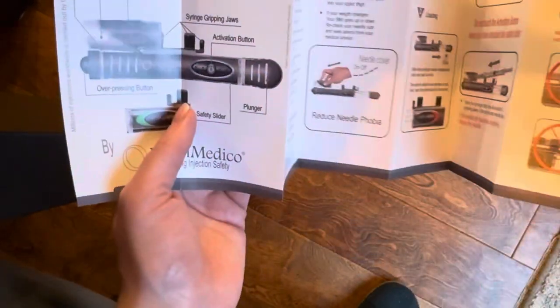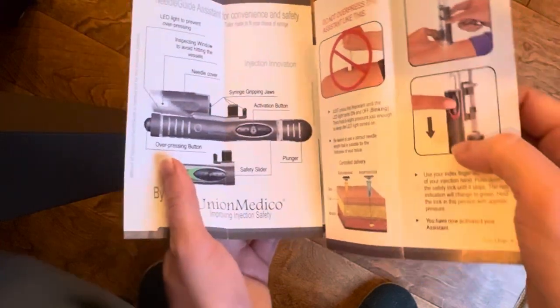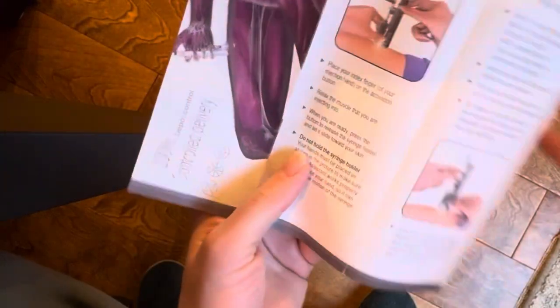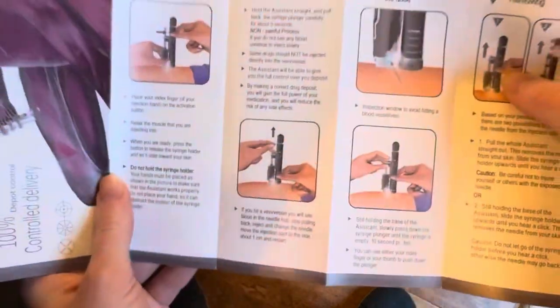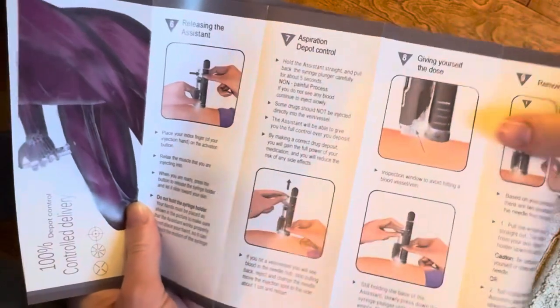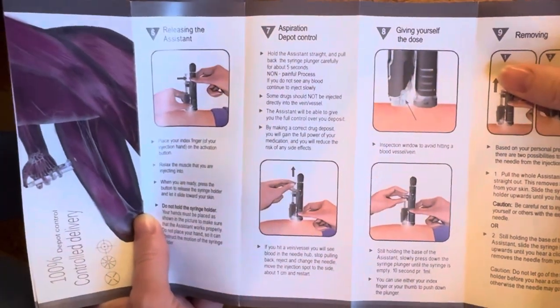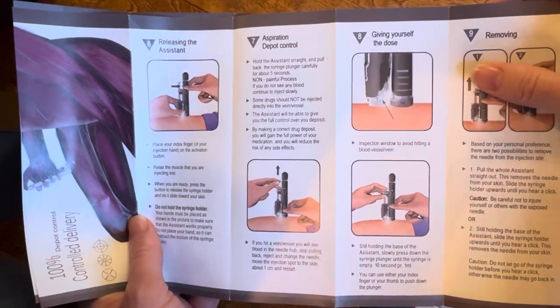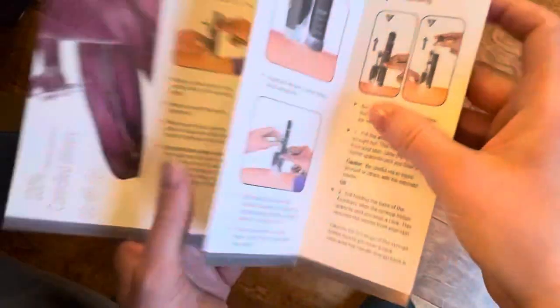I also really like that it comes with a thorough instruction manual that's easy to understand and follow. One thing I like is it talks about aspiration control — it explains pretty clearly how you can check to make sure you're not in a blood vessel. Big picture: easy to use, easy to read.